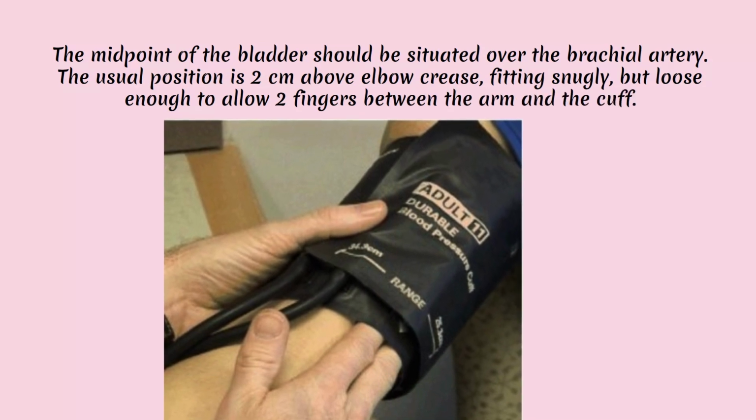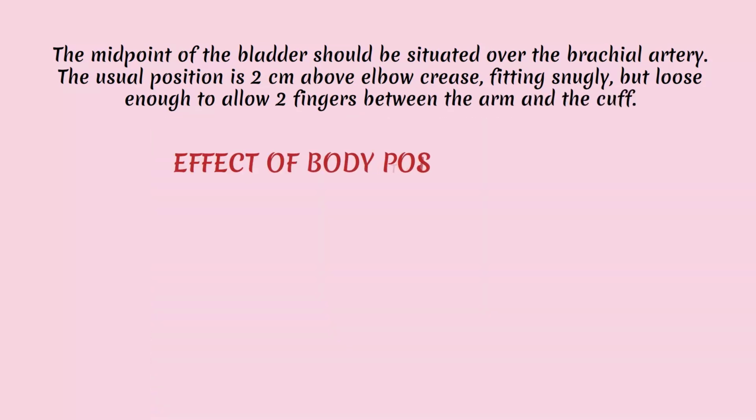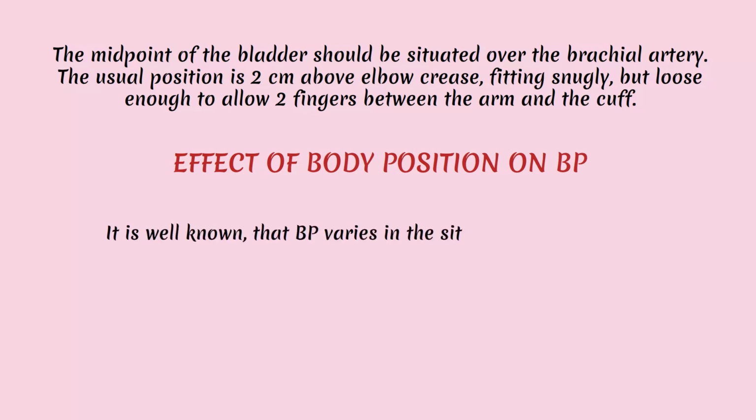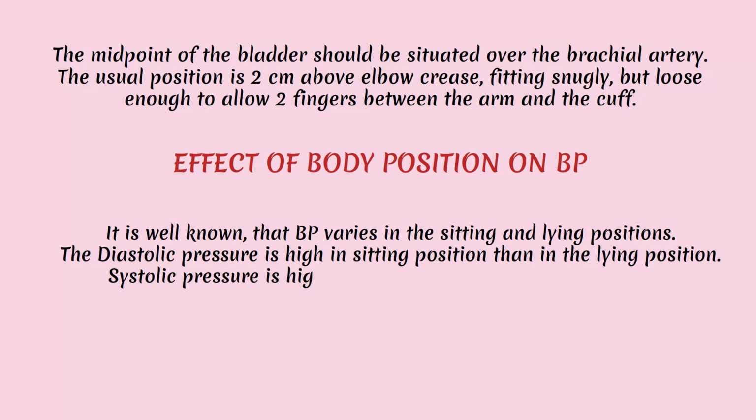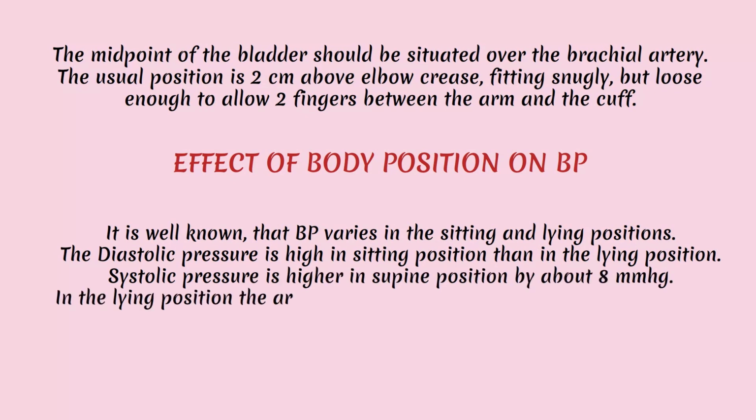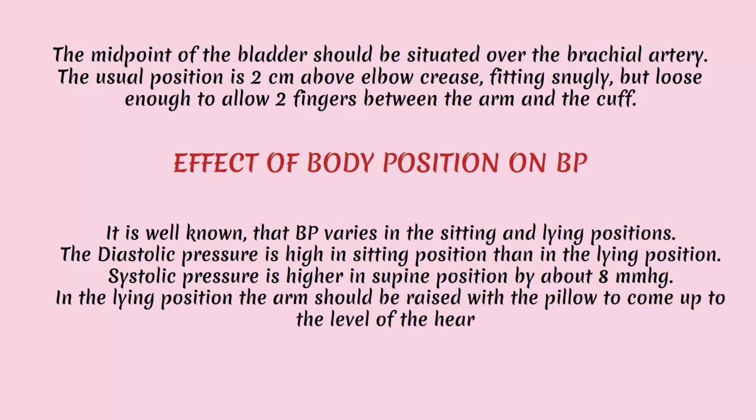Effect of body position on BP. It is well known that BP varies in the sitting and lying positions. The diastolic pressure is higher in sitting position than in the lying position. Systolic pressure is higher in supine position by about 8 mmHg. In the lying position, the arm should be raised with a pillow to come up to the level of the heart.